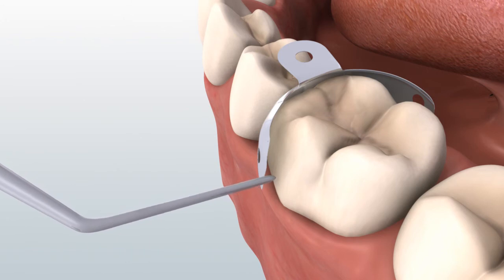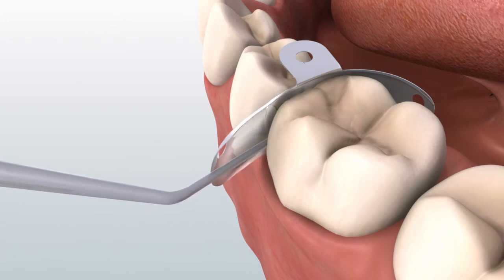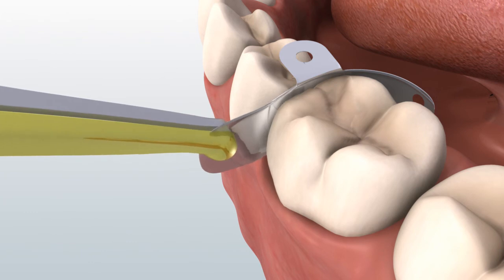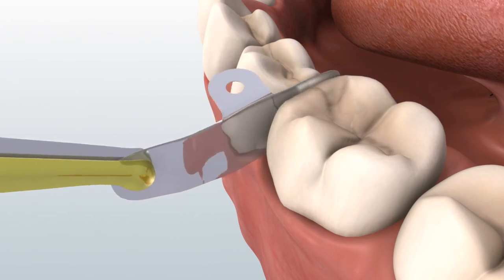Grip one of the matrix wing holes with the pin tweezers and peel the matrix away from the composite. Now wriggle the matrix free. You will have very little finishing to do because the matrix adapts to the natural contours of the tooth so well.